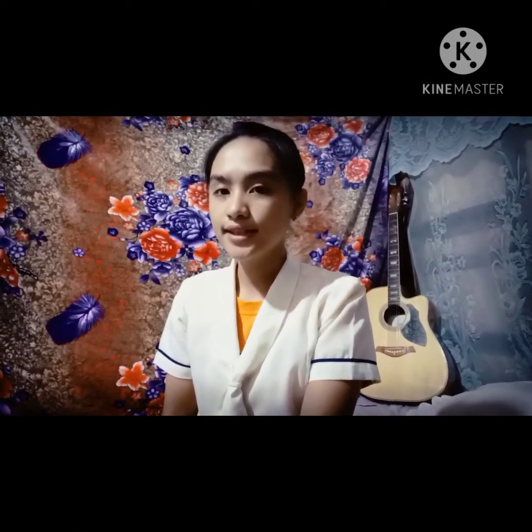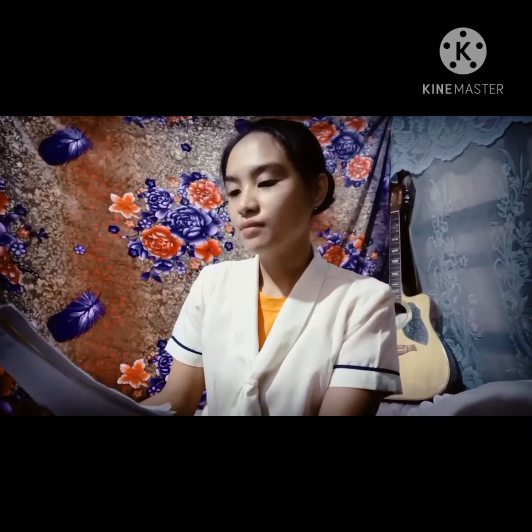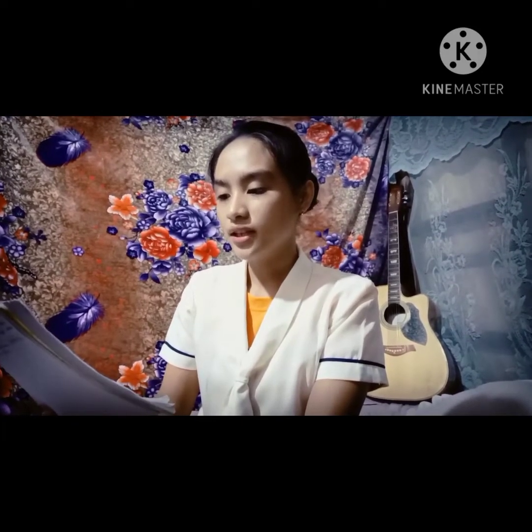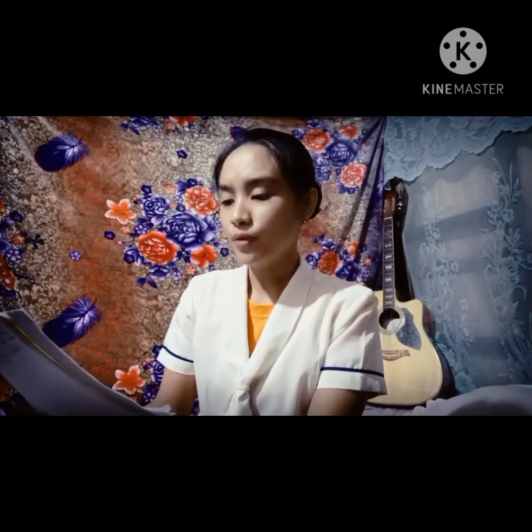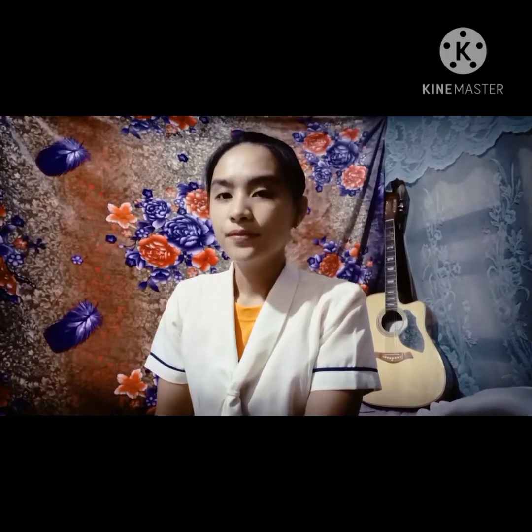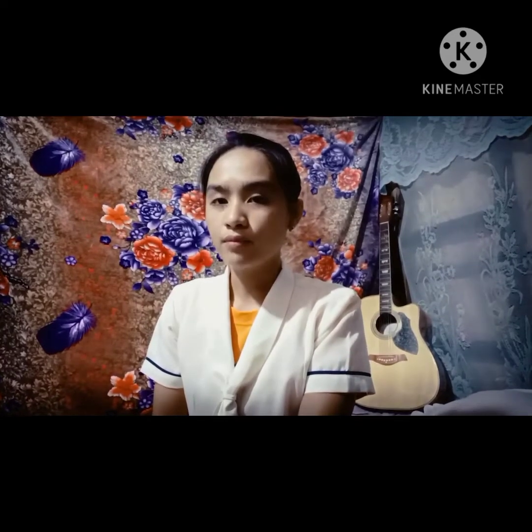Before I enter my patient's room, I have to check my patient's chart first. My patient is Miss Jenny Smith. Her birthday is November 3, 1990, and she is 31 years old, bedridden for 3 years, and unable to void for 5 hours. So I was ordered to insert a Foley catheter for her in order to drain the urine from her bladder.